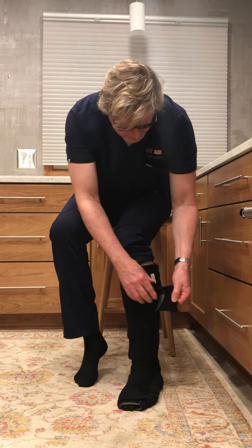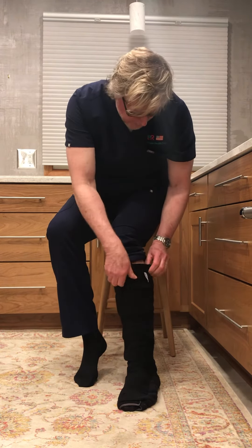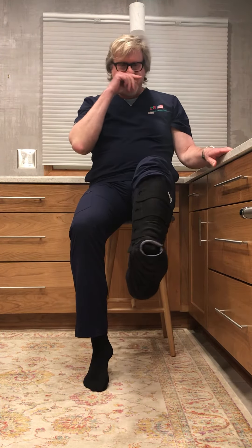Using the finger grips, pull to fit and comfort. There — the basic garment is on now.